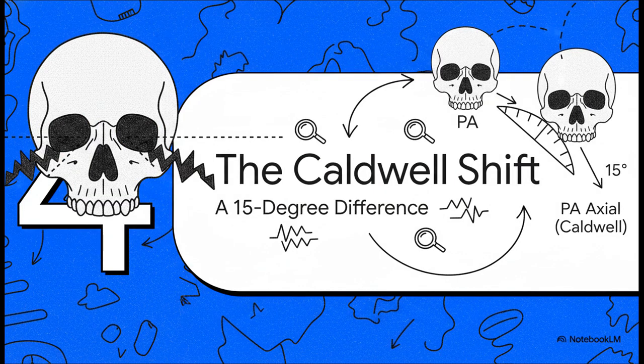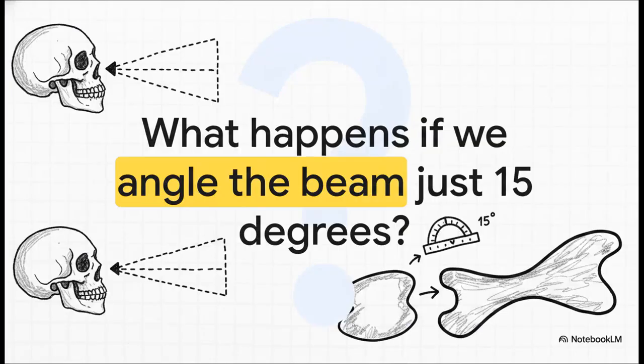Which brings us to Section 4, the 15-degree Caldwell shift. But what if the doctor actually needs to see inside those orbits? What if those dense petrous ridges are blocking the exact anatomy they are trying to evaluate?